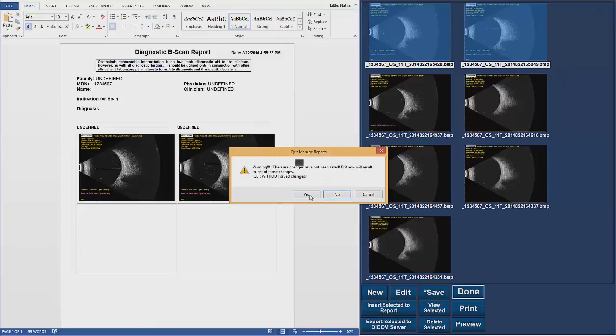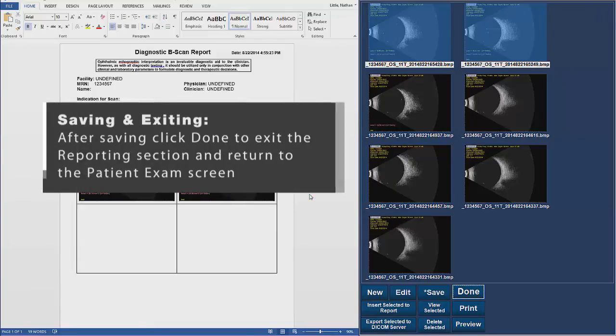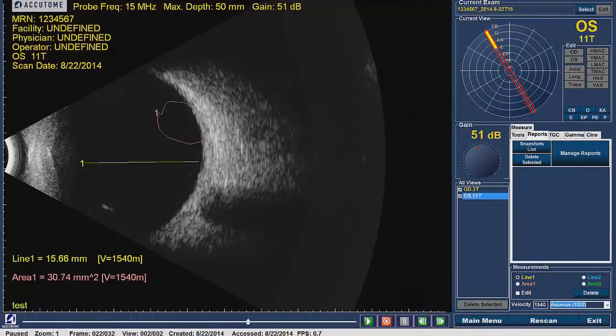Once the report is saved, click on Done. You will exit the reporting section of the B-Scan software and be returned to the patient's exam. To exit the patient's exam, you can click on Main Menu or click on Exit. This will exit the software completely.